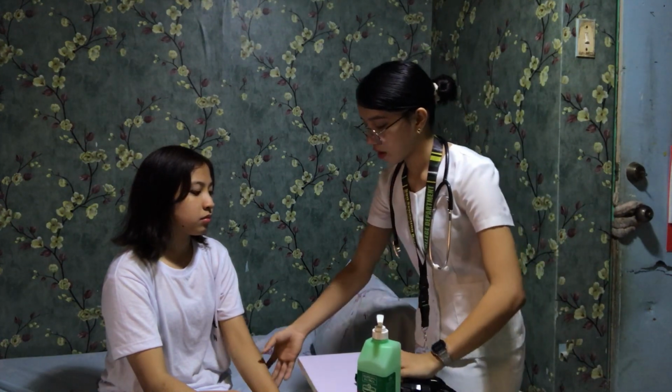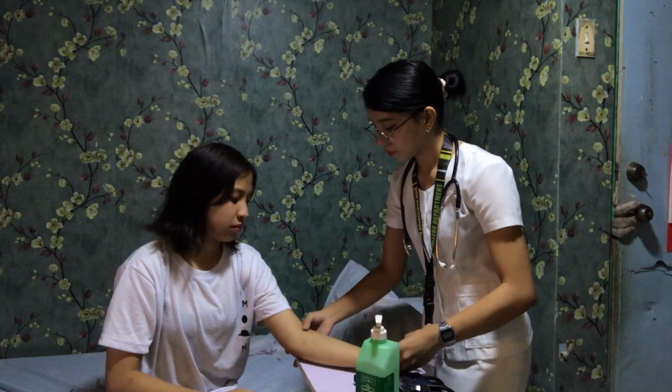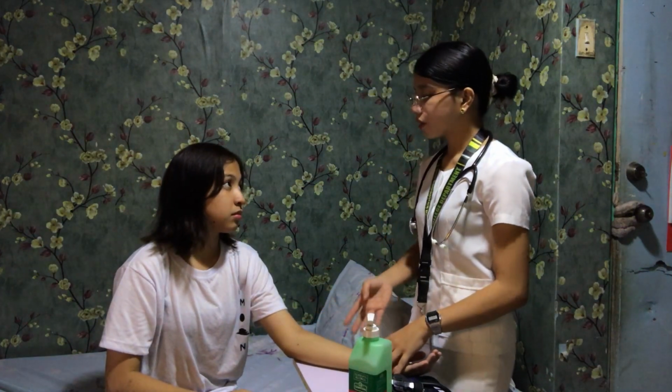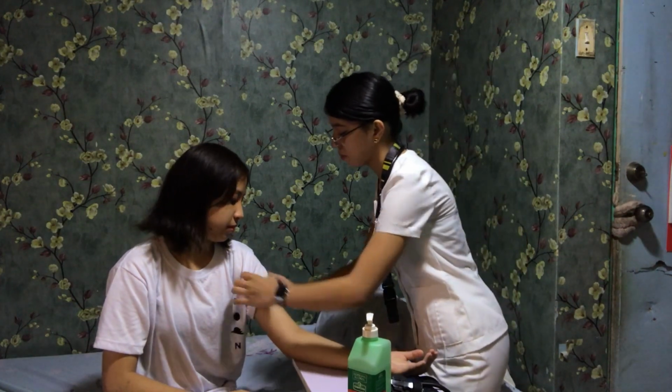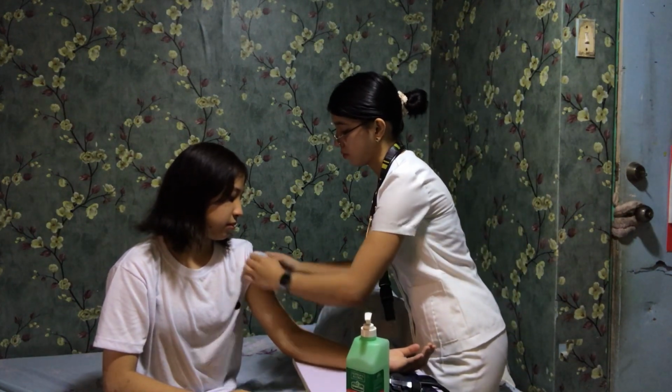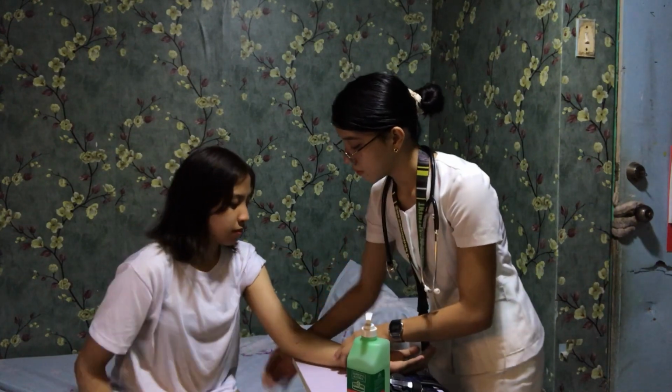Okay, ma'am, can you put your arm here? Is it okay with you if I pull up your sleeves? Okay, thank you, ma'am. Can you move here, ma'am?